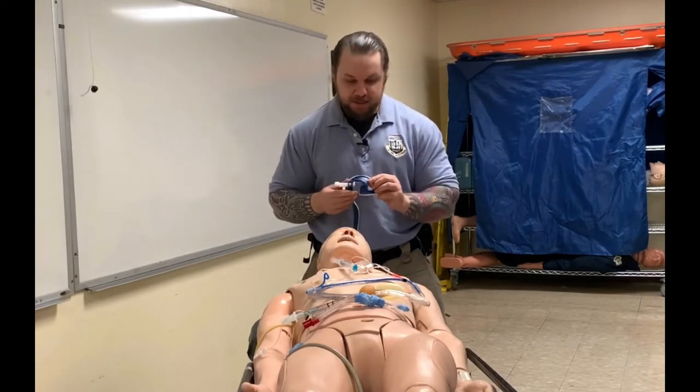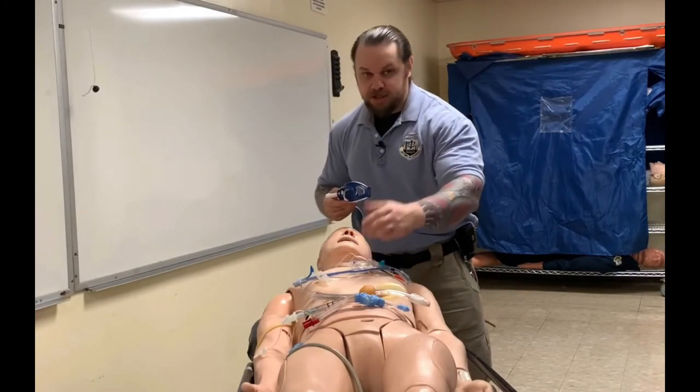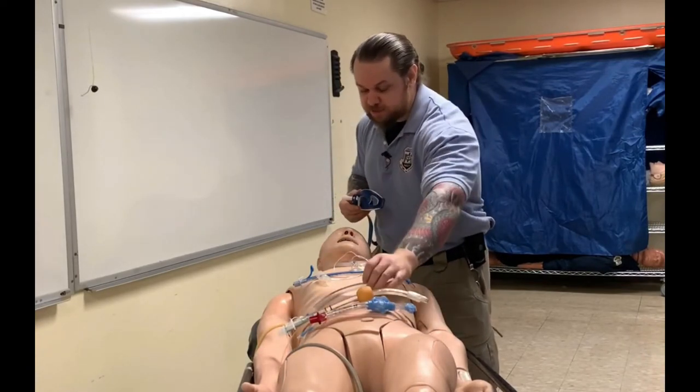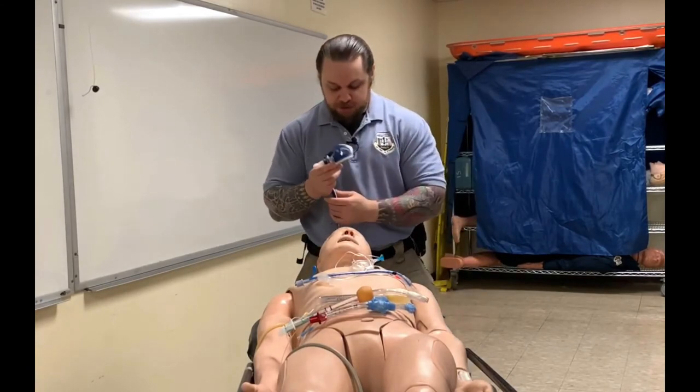What type of tubes can this device accommodate? It's certainly made for the endotracheal tube, but in addition it can be used for any supraglottic airway device such as a King tube, a Combi tube, and the LMA — so any of these devices will work.